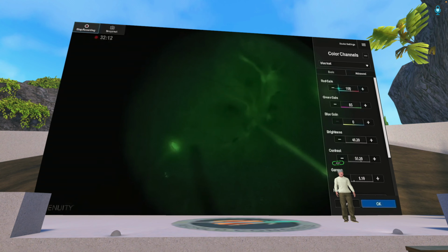So this is exactly the way I achieved my filters, with a capillary tube and spectrometer. So this is not a big deal. And since there is already an effective imaging modality, which leads the way for how digital visualization can be beneficial.